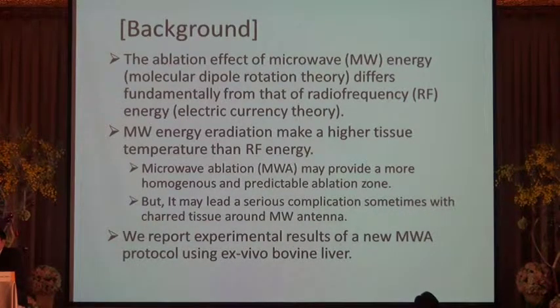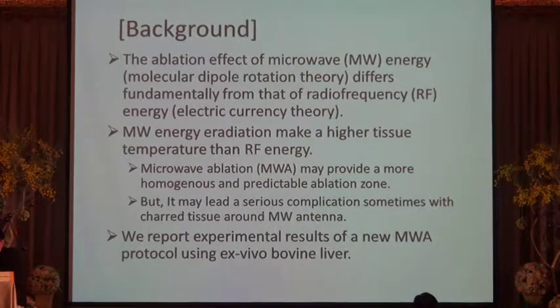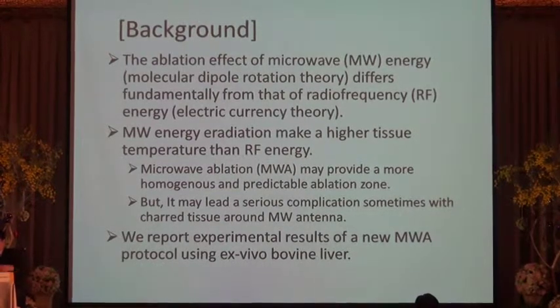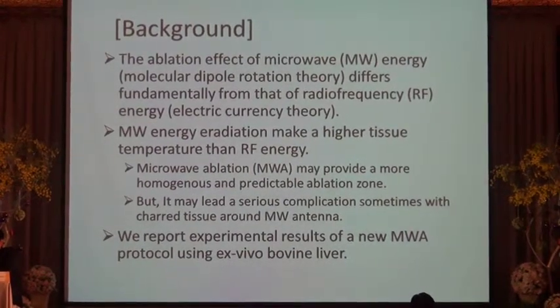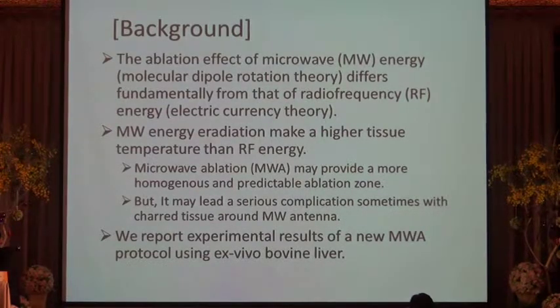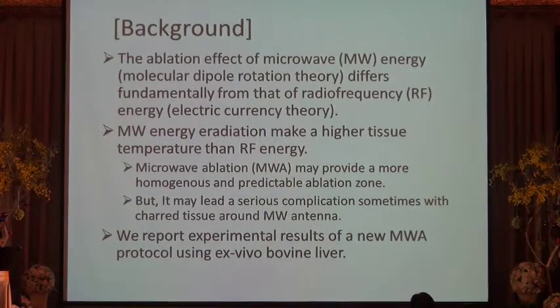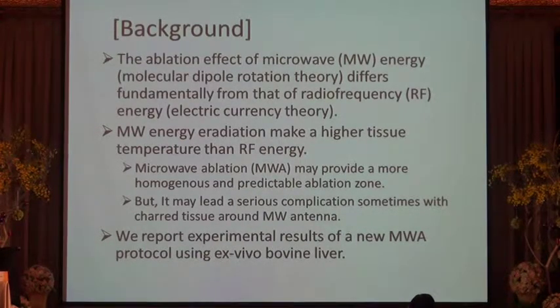And so I have experience of radio frequency ablation. Recently, maybe 3 or 4 years ago, I imagined changing the microwave protocol. So I practiced a small experimental study, and today I would like to introduce our result.